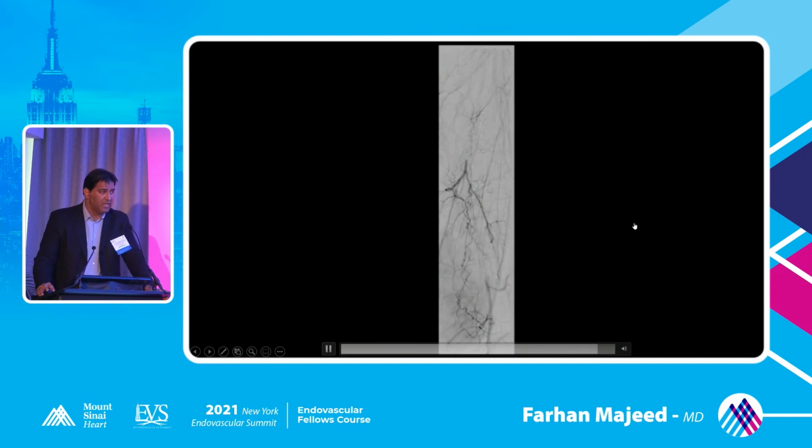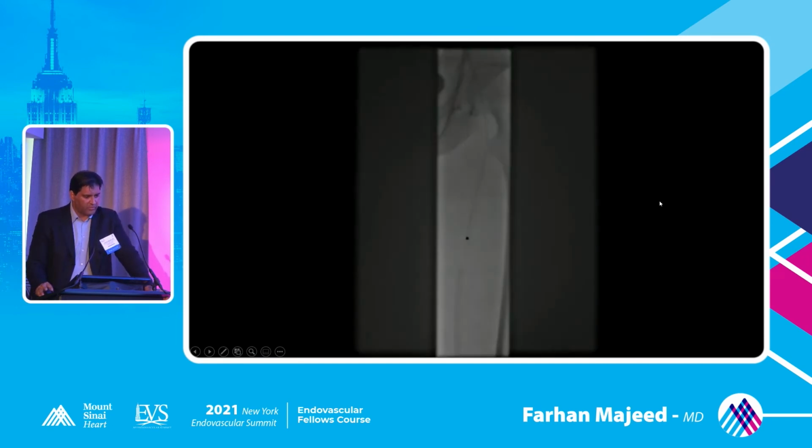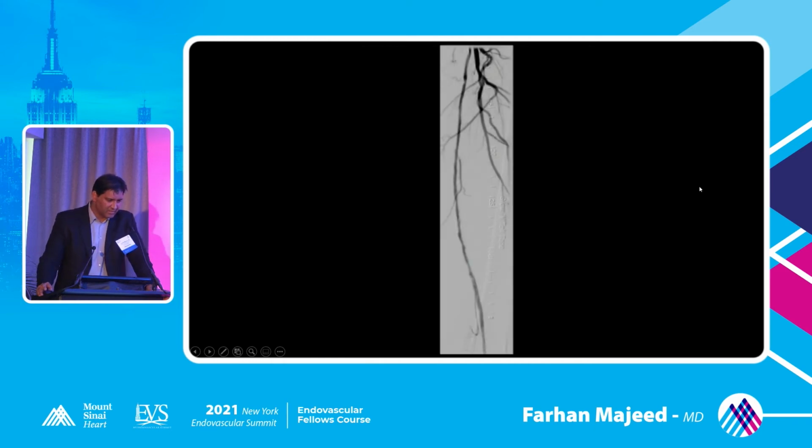So at that point, we actually did a laser, right? So here you can see we did a laser that debulks, that the ultraviolet light basically debulks the thrombus and the intimal hyperplasia. So after that, we get this.